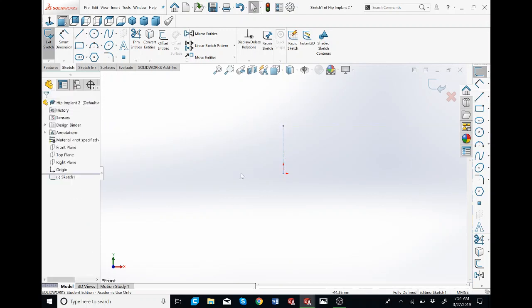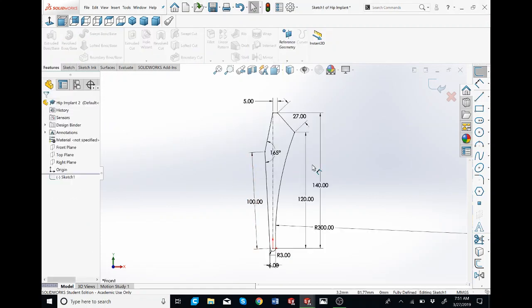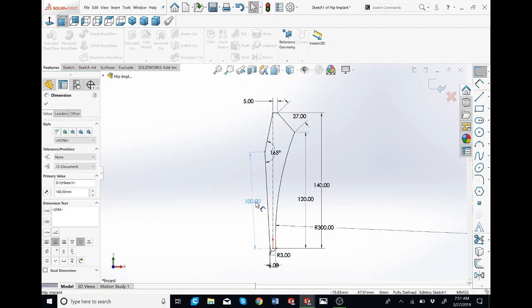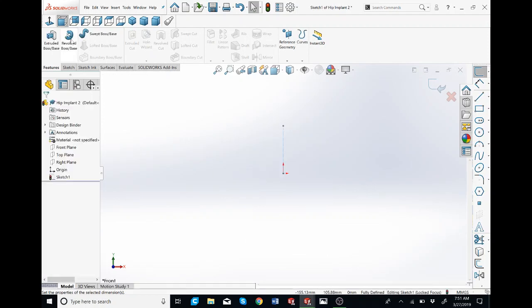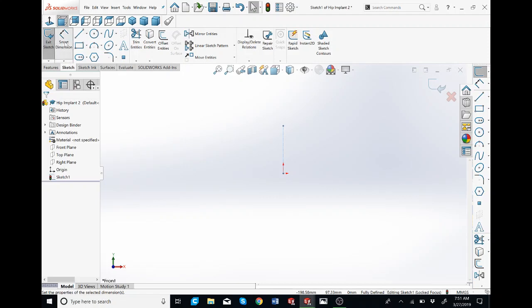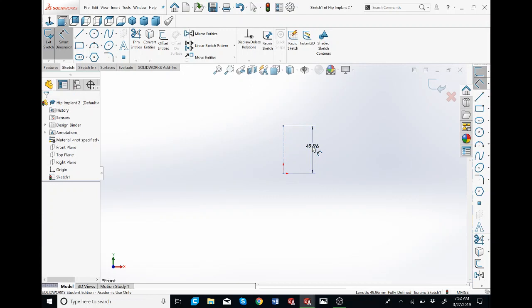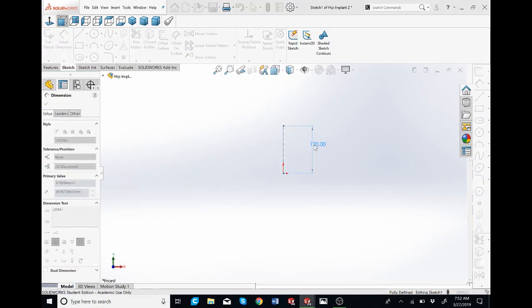I don't remember what the dimension is, so I'm going to go back to it. So we have this as 140, and then we'll probably make the next two lines — this line over here at 100 and then the slanted line with 165 degrees. So going back, I'm going to click on the Smart Dimension tool on the sketch tab and make it 120. Just click on the line, move it to the side, enter 120, enter.